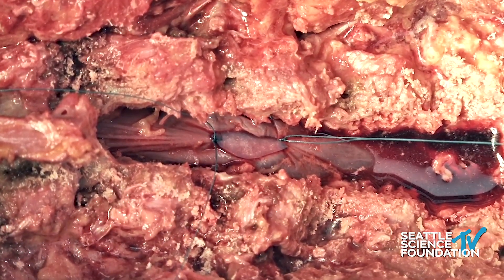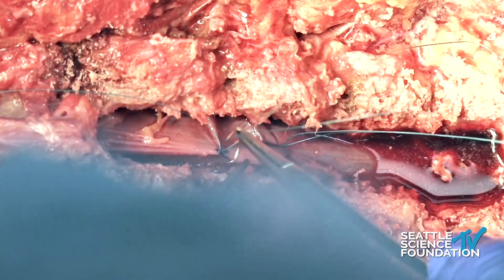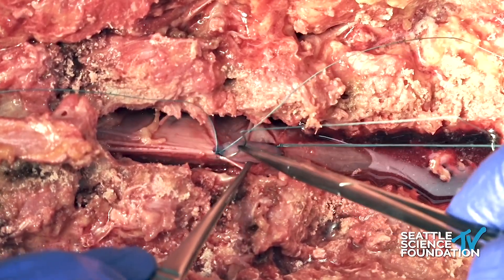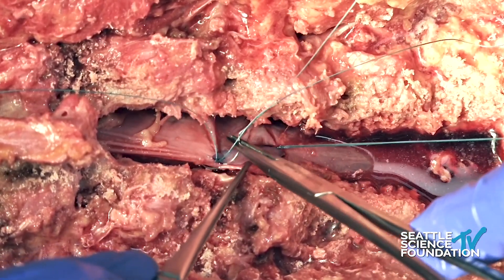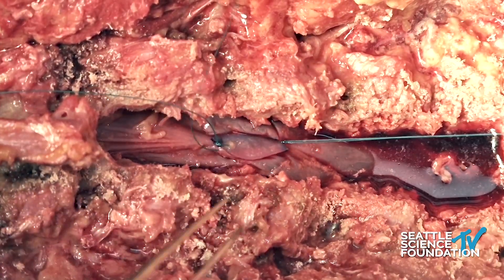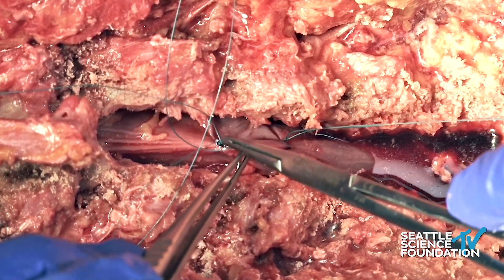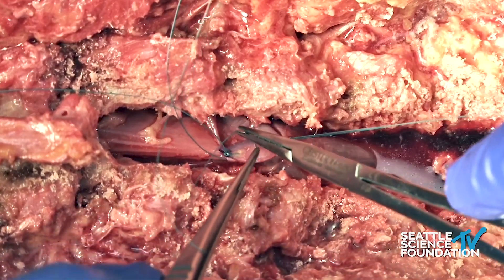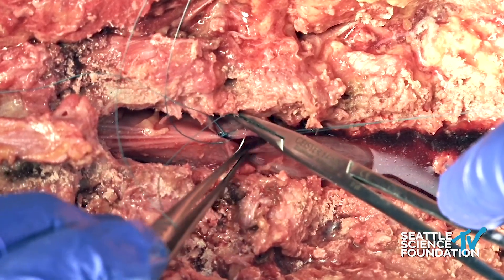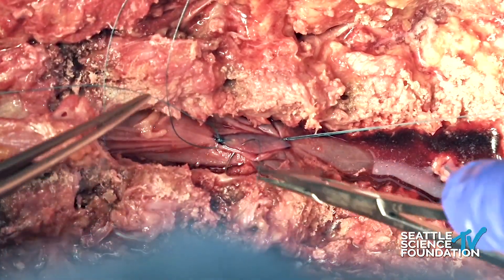The dural graft is now secured to the apices of the durotomy and we are going to begin suturing the graft. We intentionally got rid of the microscope to have the overhead camera because the picture quality was better. In the interest of time I'm going to advance these a little bit more than I normally would. Normally I would space these sutures around every two to three millimeters. The key is to make sure that the bites of the graft and the bites to the native dura are narrow enough.